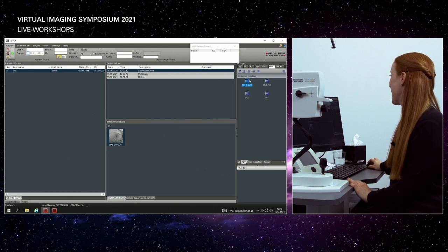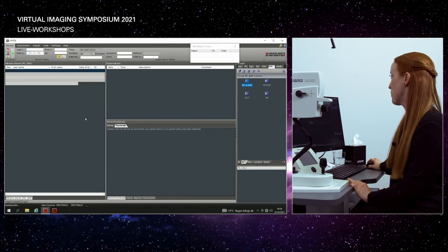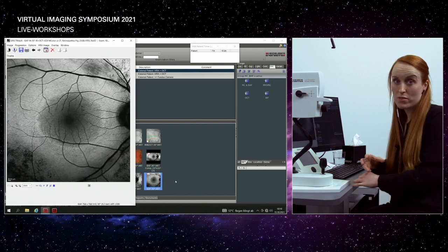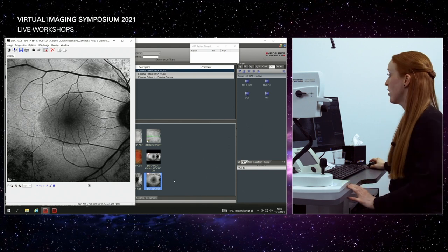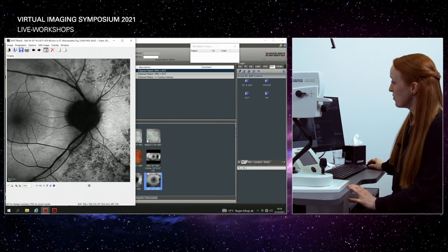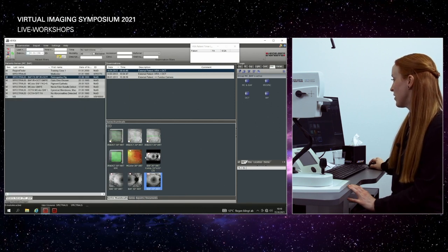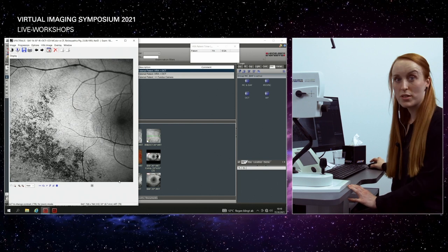Okay, and as Ethan already mentioned, this blue autofluorescence can be used to detect special patterns that build up in each and every pathology, okay? For example, here we have a retinitis pigmentosa where you lose the activity in the edges of this field of view, and you have only some islands left, okay? So you can see those patterns that build up right here.